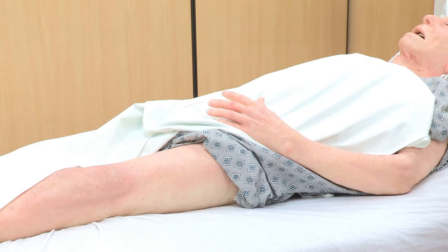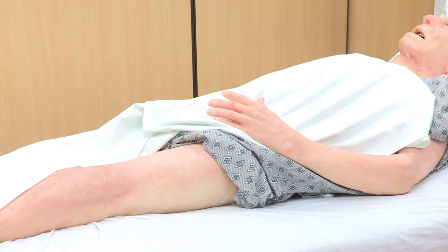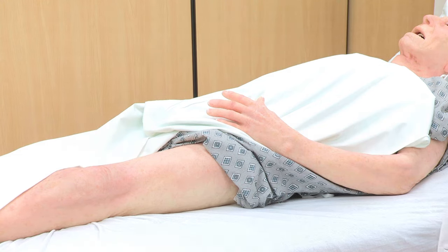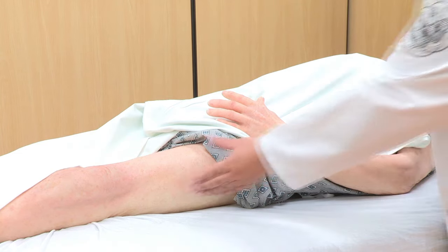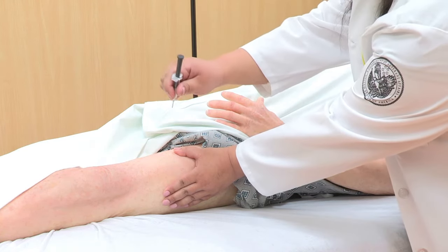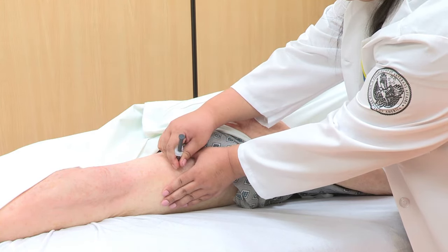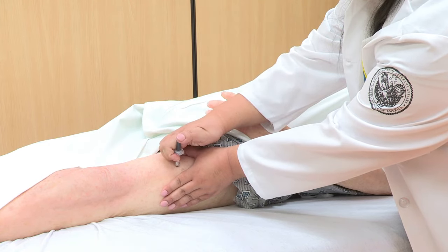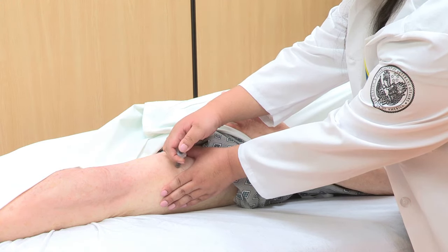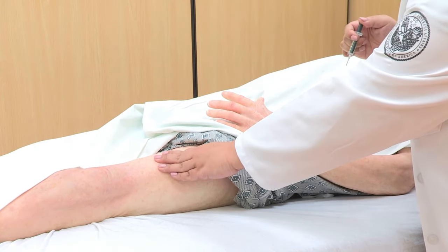Select a site for injection. Glucagon can be injected into the thigh, buttock, or upper arm. If you are unable to remove clothing in a timely manner, glucagon may be injected through clothing if necessary. With one hand, gently pinch the skin at the injection site. With the other hand, holding the syringe like a pencil with the needle down, insert the syringe needle into the injection site in one quick motion, straight up and down. Using your thumb, push the syringe plunger handle all the way down until all the medication is injected. Once the syringe is empty, pull the syringe straight up out of the skin and apply light pressure on the injection site.